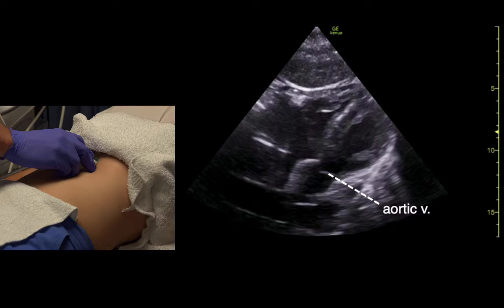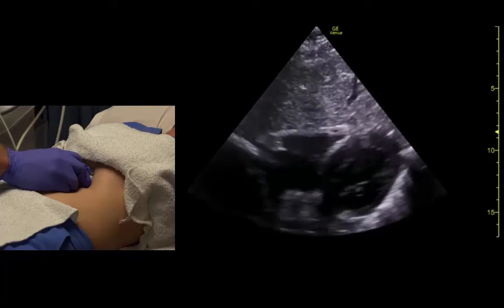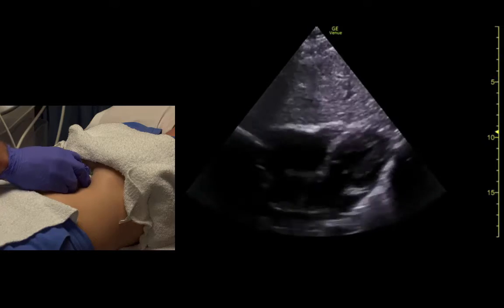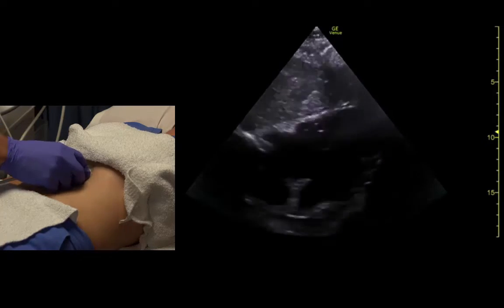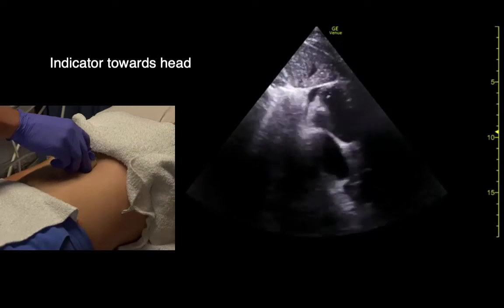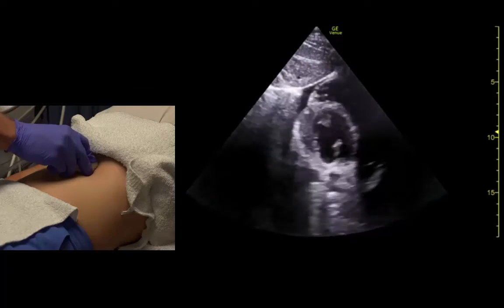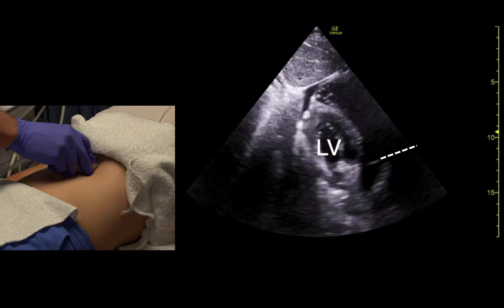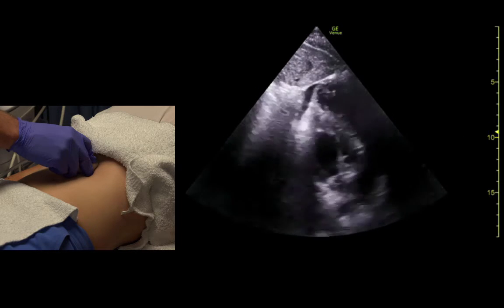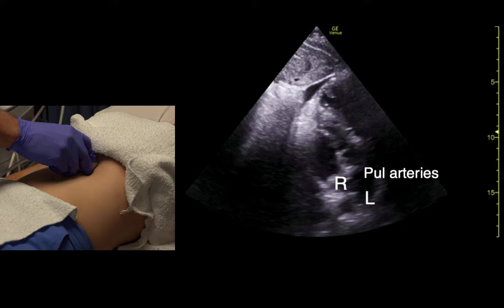Sometimes if you flatten the probe, you can see the aortic valve from this view. We can really see the tricuspid well. And in some patients, if they have a good sub-xiphoid view, we can get short-axis views. With a big breath, we can get this view out here where we see the pulmonic valve really well, and we can even see right and left pulmonary artery branches right down here.